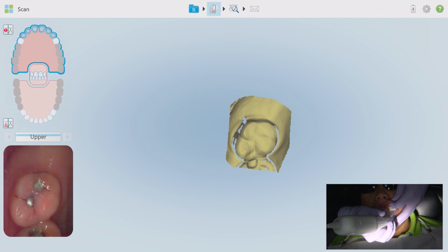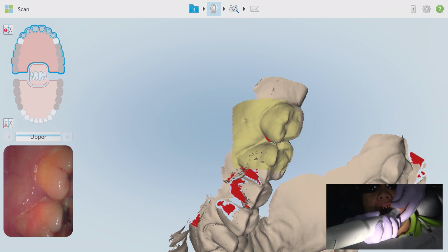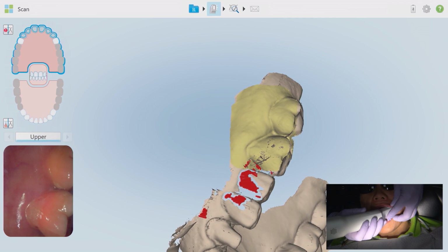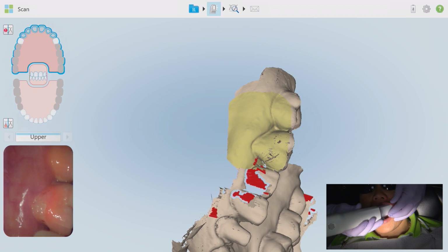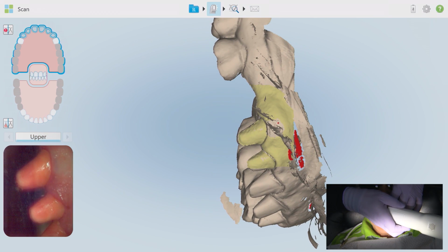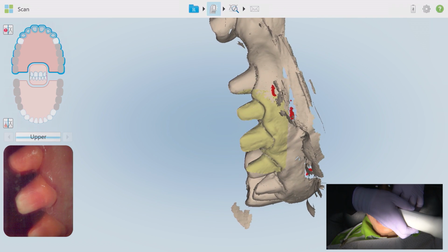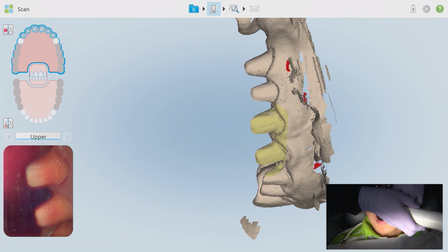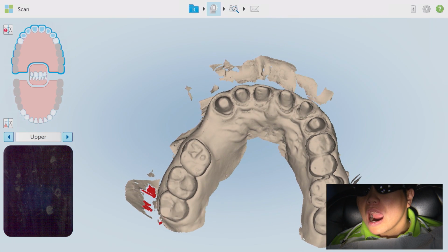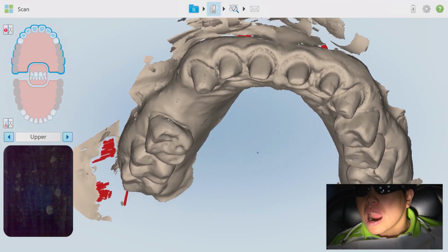Now begin scanning the occlusal surface until the scans mesh together and then move to the buccal surfaces. Acquire the interproximal data by rocking the tail of the wand up and down as it travels to the midline where the scan can be stopped. Perform the same process from the distal occlusal of the contralateral side. Move towards the buccal surface and travel to the midline, stopping when the buccal scan meets the previously acquired data. Take another look around the arch after completion to make sure nothing needs to be filled in, and if not, continue to the opposing arch scan.